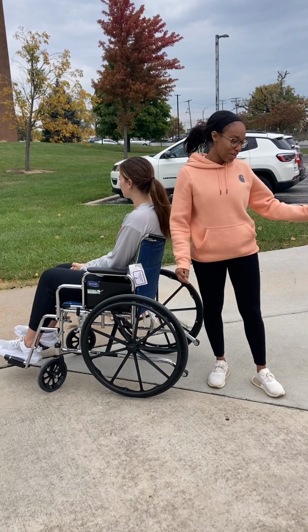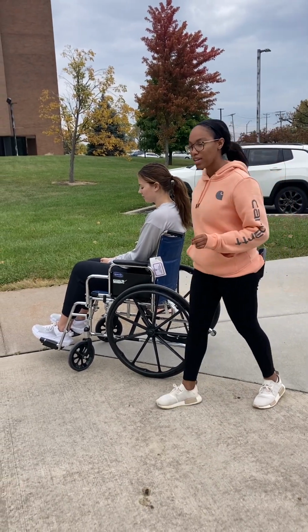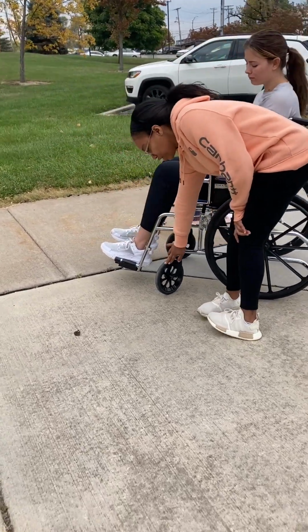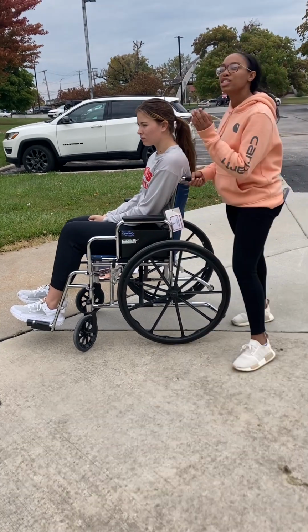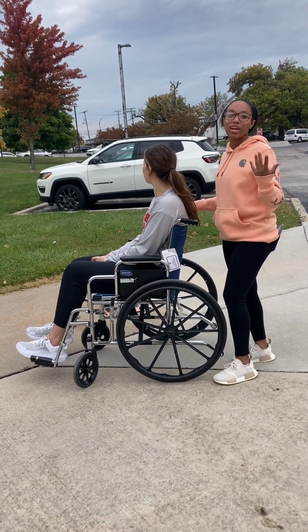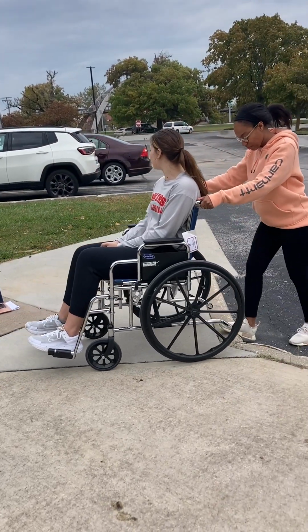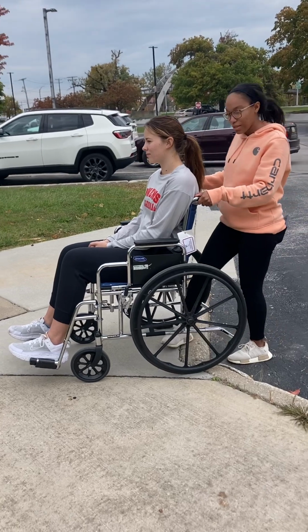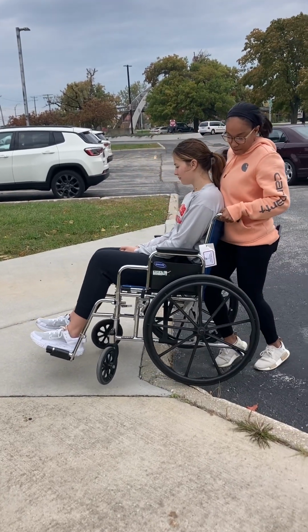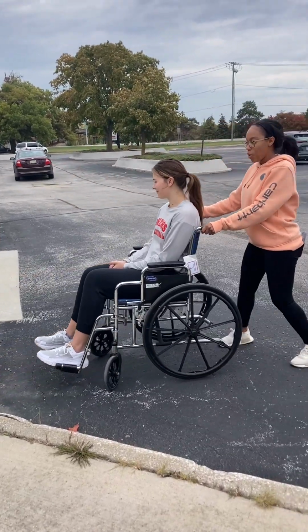Okay, so now we're gonna go up and down a curb. One thing, or two things, we need to talk about first is making sure your feet are planted up and your wheels are straight. You're gonna instruct your patient that you are going down a curb, so just brace yourself. So we're gonna go to the curb, and then using my leg and my hip, I'm gonna help us lower, and then lower the back. Go.